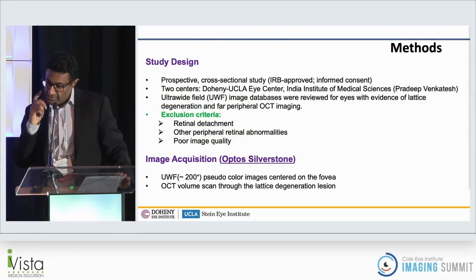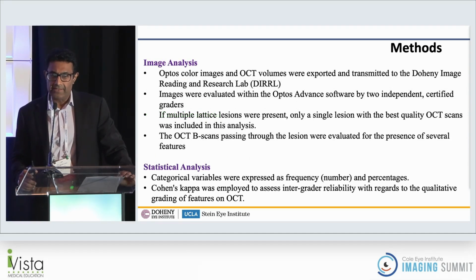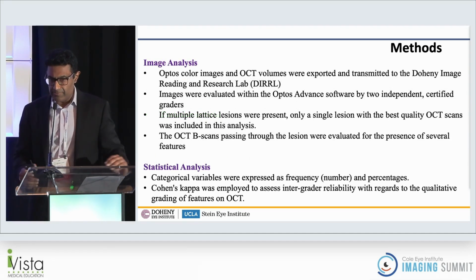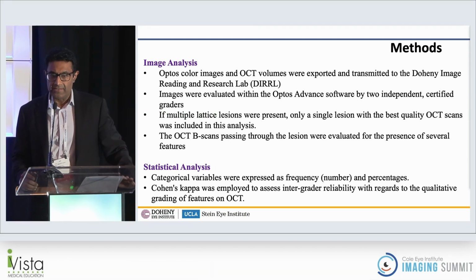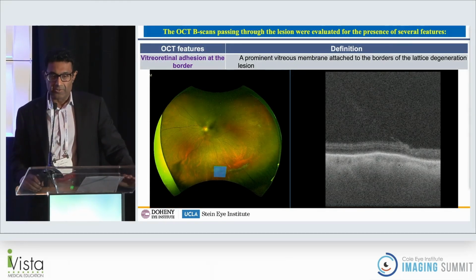So what I'm going to show you are the results of a study that we did in collaboration with a colleague in India using the Silverstone device to prospectively image lattice patients, and then we reviewed them all in the reading center in a masked, independent fashion by multiple graders.